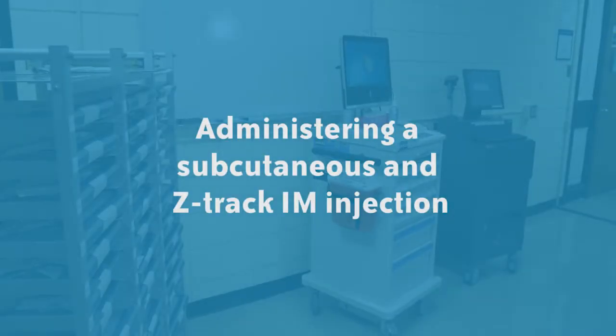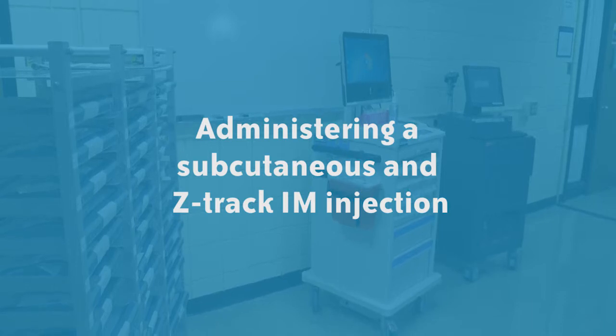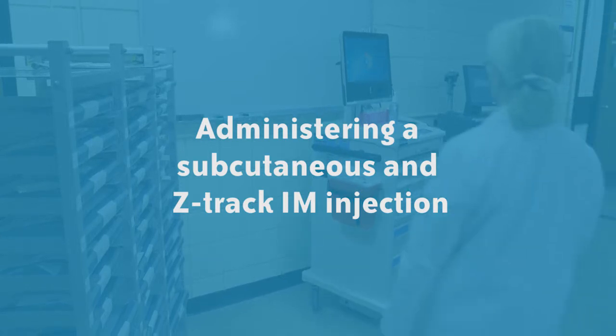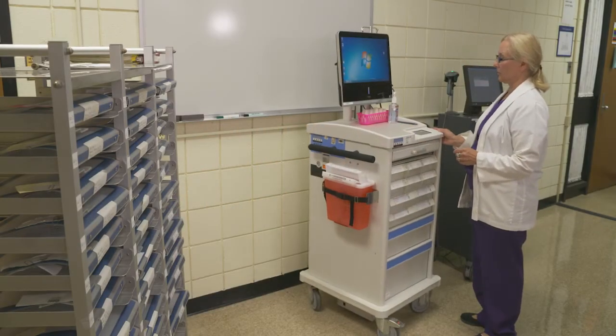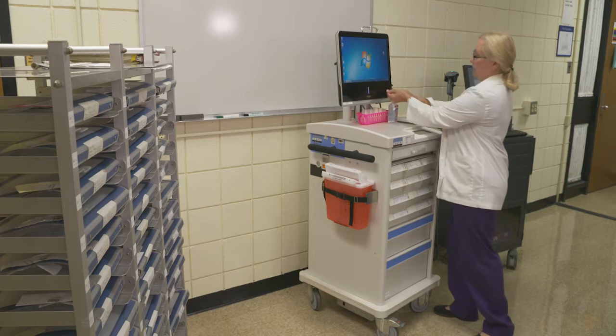This video will demonstrate the procedure for administering a subcutaneous injection and an intramuscular injection. The nurse will be administering 0900 meds to Mike Tyson. The nurse will first complete hand hygiene.